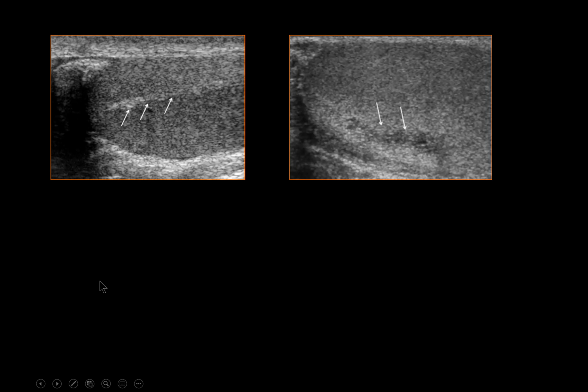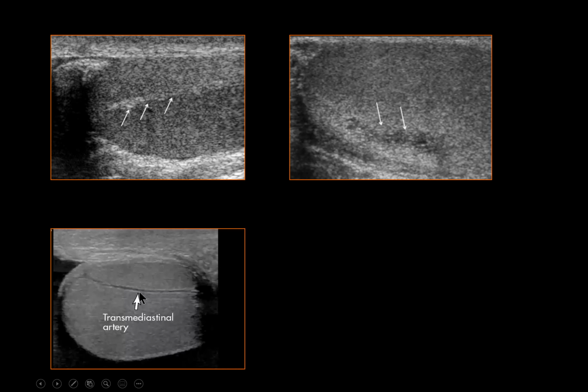And this is the intratesticular band, also known as a vascular cleft. It is a hypoechoic band in the mid-third of the testis, nearly perpendicular to the mediastinum on sagittal scan. This band is visualized in about 10% of normal testes, and it measures up to 3 millimeters in diameter and 30 millimeters in length.